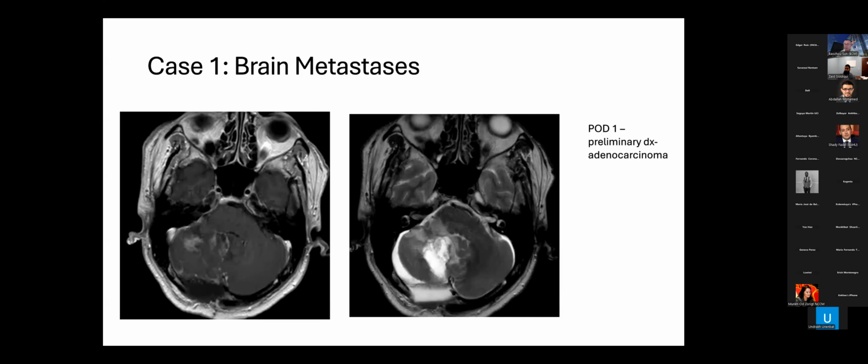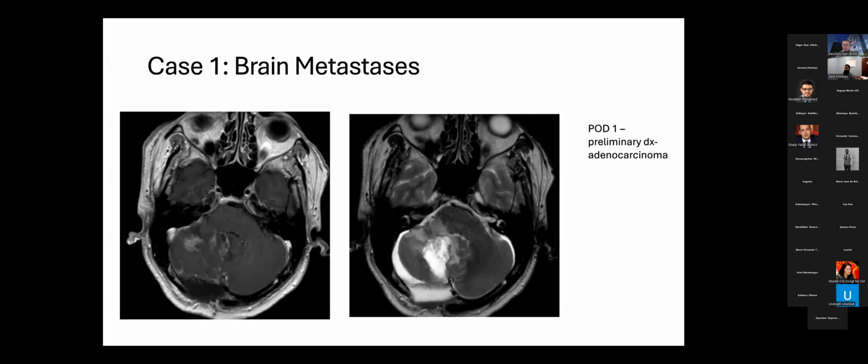Secondly, our neurosurgical colleagues prefer that there's some amount of healing that is done, especially in the approach area. So the subcutaneous tissue, the dura, and whatever they use to seal the brain has a chance to heal. And usually that healing process takes a couple of weeks. The tumor cavity also stabilizes after approximately 2 to 3 weeks. So that is the point at which we usually intervene with radiosurgery.